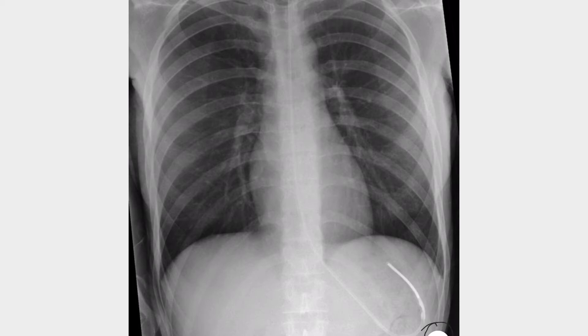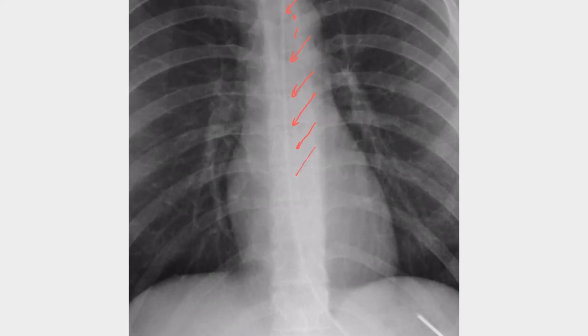This is a perfect NG tube positioning. The main concern with NG tube placement — the whole point of doing the X-ray — is first to make sure it's not sitting in the lungs, and next to make sure it's in the stomach. You can see this thin line here; this is the NG tube. It's going straight, crossing the carina in the middle.